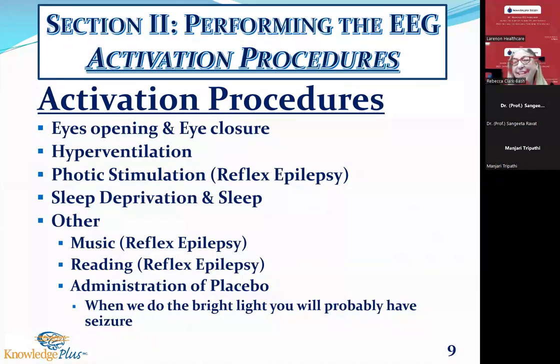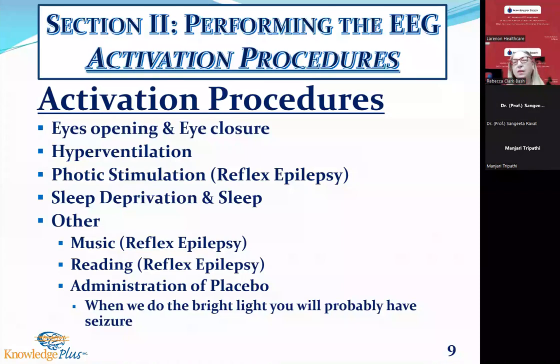Lip licking. Is that a seizure? Most lay people think no. What if the patient simply, in the middle of talking to you, stares away? That doesn't look like a seizure to lay people. So I really need drowsiness and light sleep. I don't need deep sleep. I don't need REM. In a routine EEG, the most sensitive sleep stage is the transition from drowsiness to light sleep.